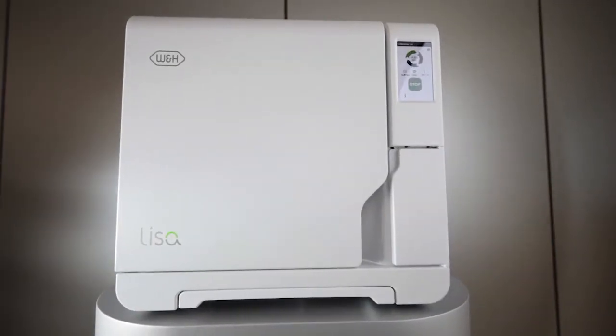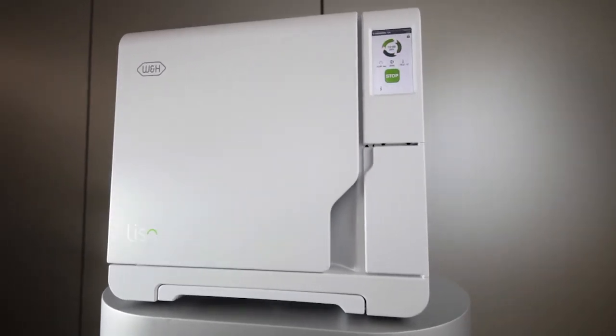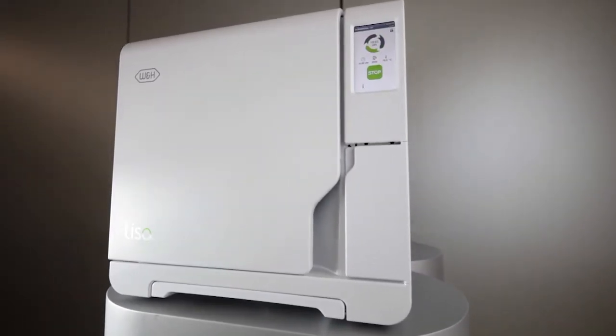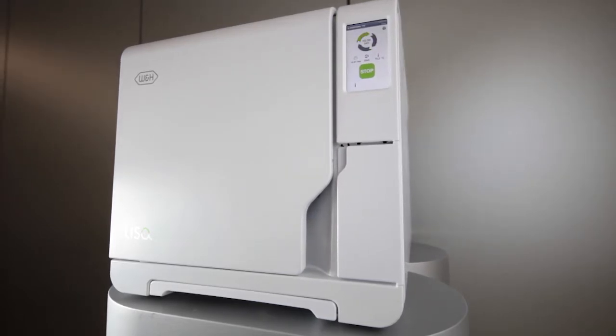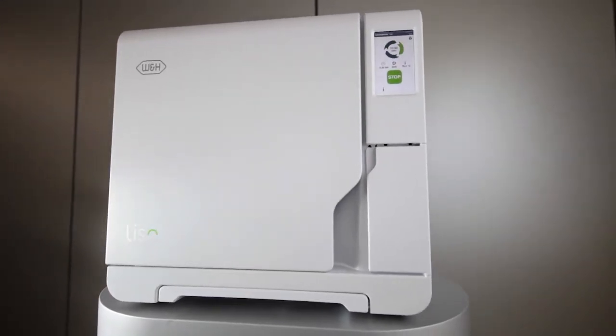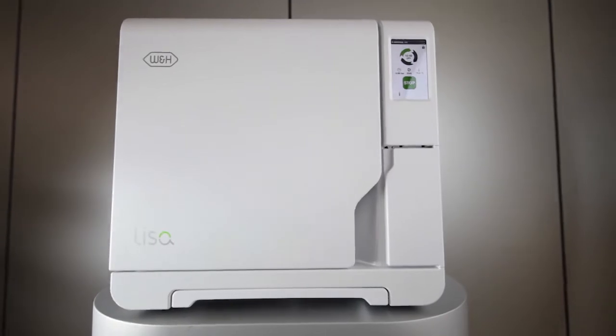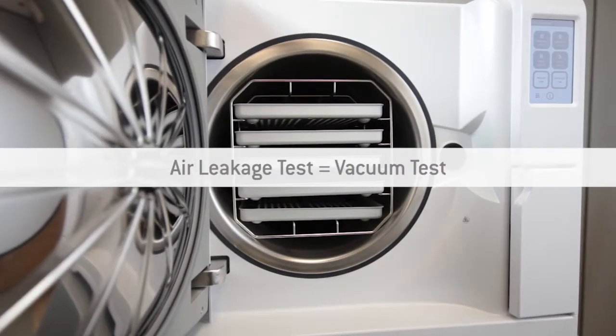Modern sterilizers are subjected to regular tests during their lifetimes. Because the W&H Lisa is a Class B vacuum sterilizer, an air leakage test must be carried out as described in the manufacturer's instruction manual and your National Hygiene and Decontamination Guidelines. The Lisa air leakage test is referred to as a vacuum test.